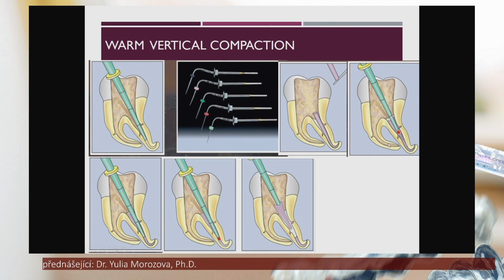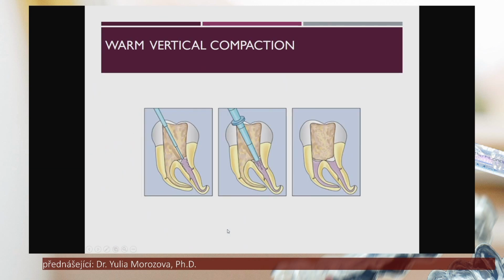Of course, first of all, we should put the sealer, because, as you know, gutta percha is not used without the sealer. Also, in this case, we will use a really small amount of the sealer. After we seal this apical part, we put the next gutta percha cone and apply the heat, gradually leaving 2 up to 3 millimeters of gutta percha, and gradually we will fill all of the root canal. Finally, we provide the vertical compaction using the normal plugger.